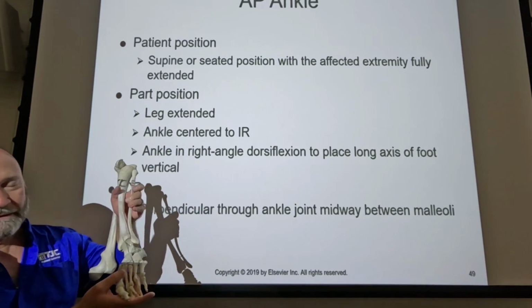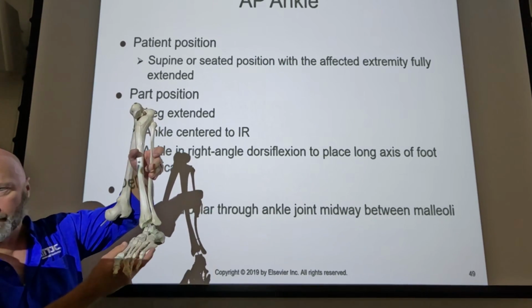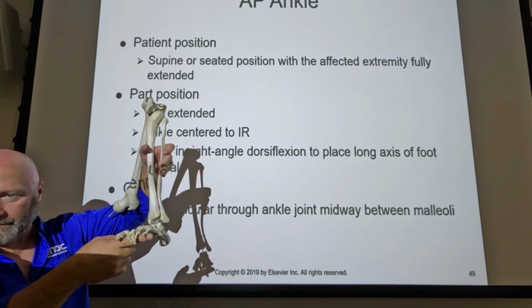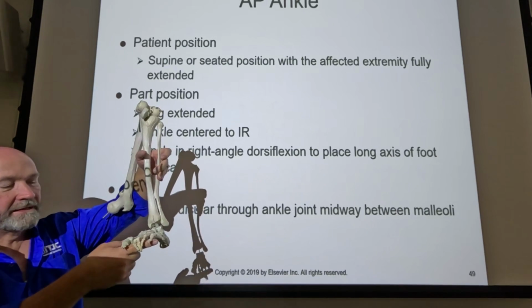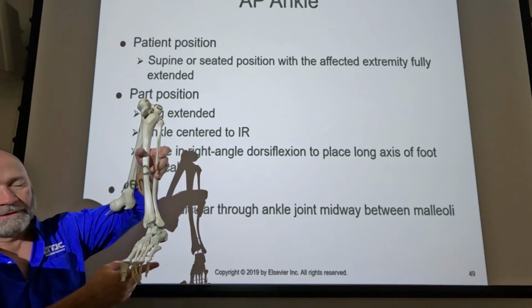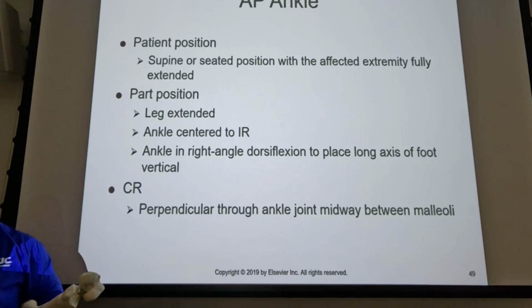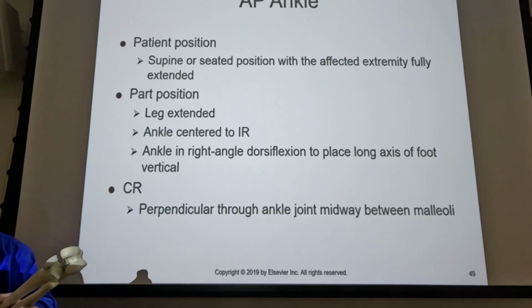So your patient, I can tell you from experience, I've got bad ankles. I've twisted them really badly all my life, but it's going to be very painful for the patient to get their foot into 90 degrees dorsiflexion. And previous editions of the book have said that if you don't get to 90 degrees, then you're going to have that in the joint space, and that's quite a bit of plantar flexion there, right? So I was kind of glad to see in this edition of the textbook that they made the distinction that some degree of plantar flexion is not really going to interfere with joint space.